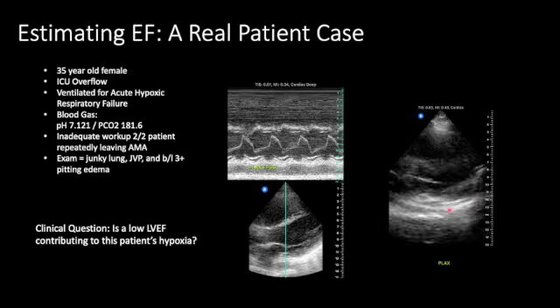But I think we definitively ruled out that this patient was having a low EF on the left side of the heart to justify her symptoms, which then turned my question to the right side of her heart, which is where we'll be going next week. And in fact, this case is where we'll start off our next lesson in our module about cardiac POCUS. We'll see you all then.